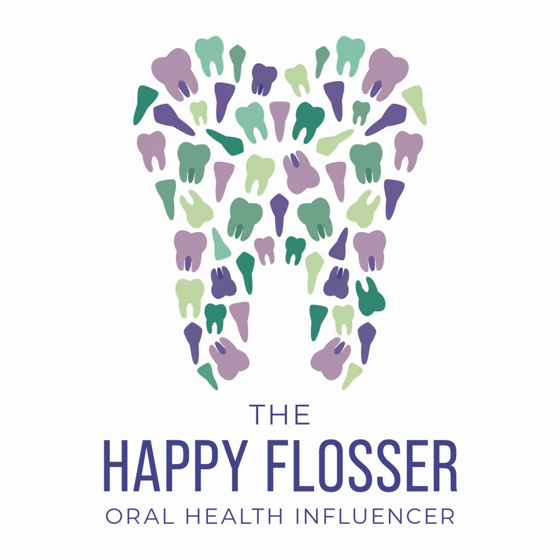So some of the early bone changes are fuzziness of the crestal bone and early detection of the evaluation of that horizontal bone loss, drawing that parallel line, using your instrument to kind of see where that horizontal line would go between the CEJ to see if you can detect some early bone loss. The vertical bone loss, that destruction of the interproximal crestal bone, creating that acute angle, you want to see if you can find that at the earliest stage. So you're looking for that triangulation.